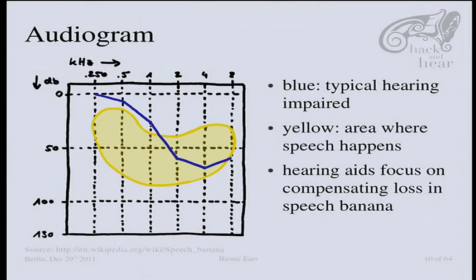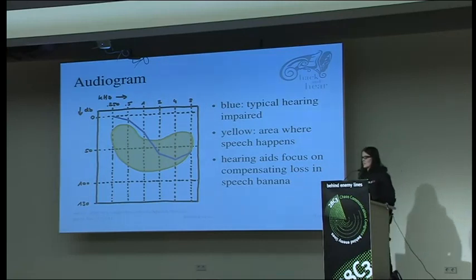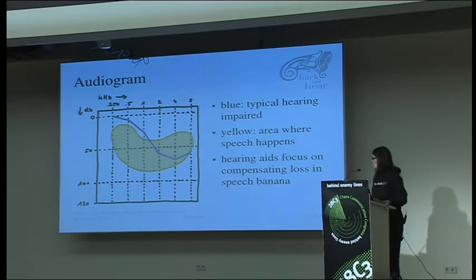And you can see the blue line here. So half of the banana is actually cut. And this is the high frequencies, which in speech are the consonants like S and F, for example. The vowels are usually understood quite well.